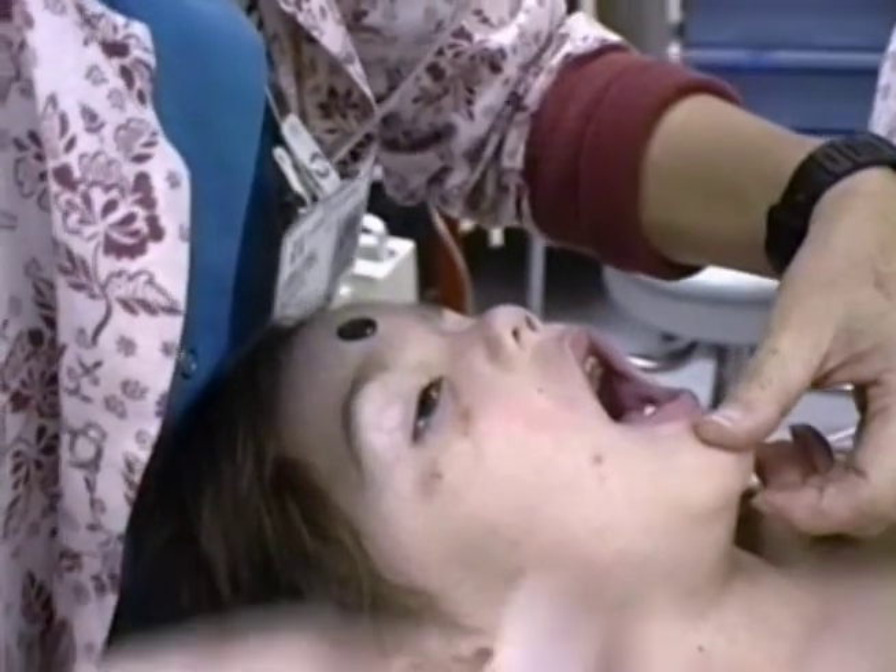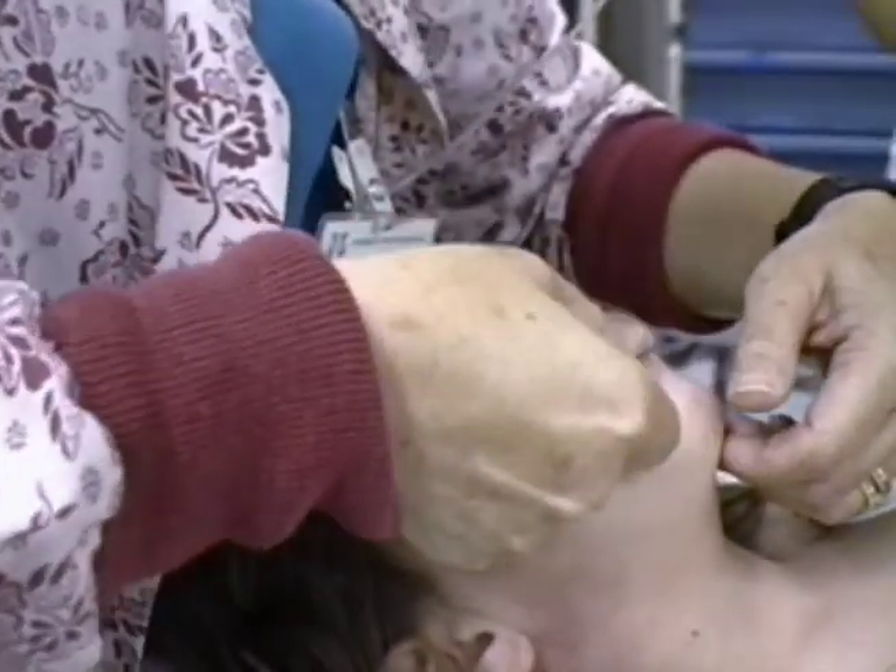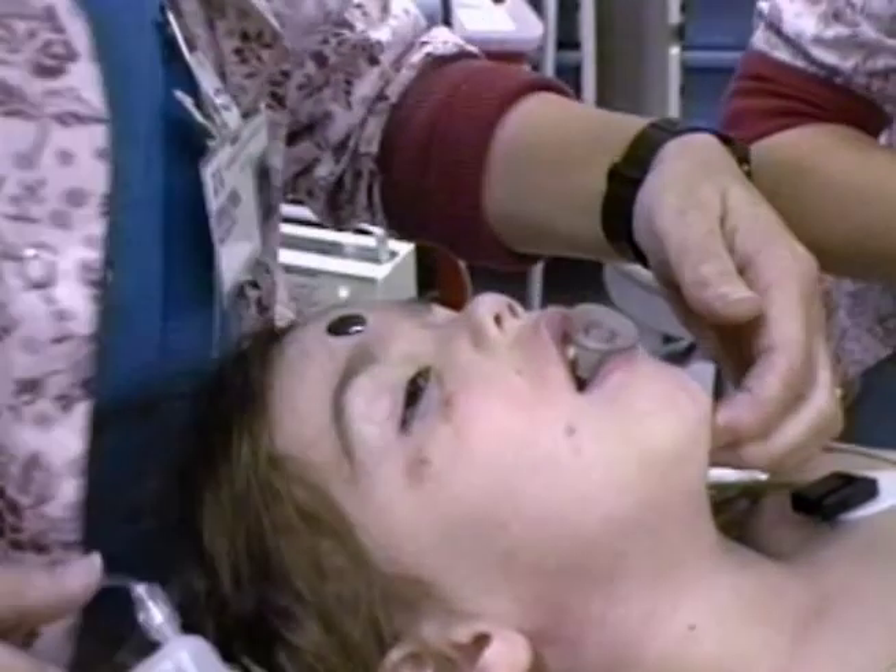While an awake patient often won't tolerate an oral airway, it's often a better choice than a nasal airway in unconscious children. The oral airway avoids the risk of bleeding caused when a nasal airway injures hypertrophied adenoids.